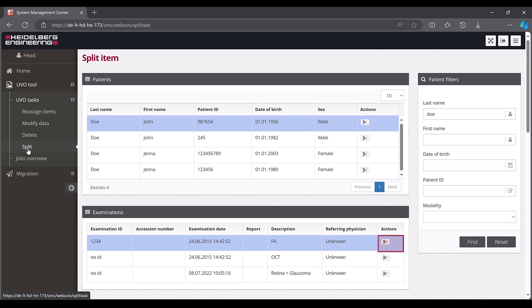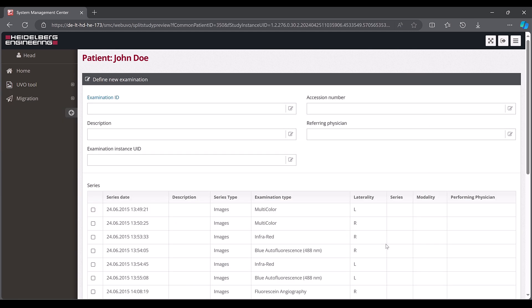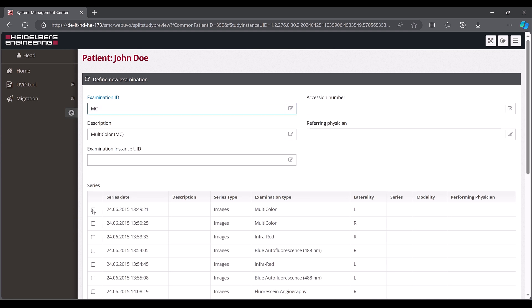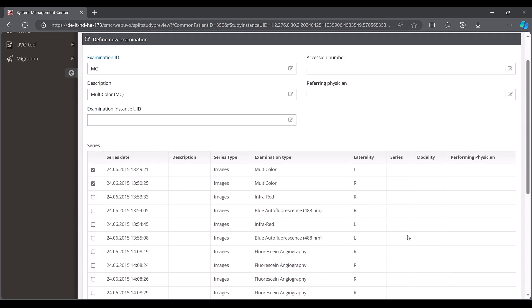Click the scissor symbol, in this case at examination level. Add a description to the newly created examination and fill in the additional mandatory field, examination ID, for example with an abbreviation of the description. Then select the data to be separated and confirm with create.